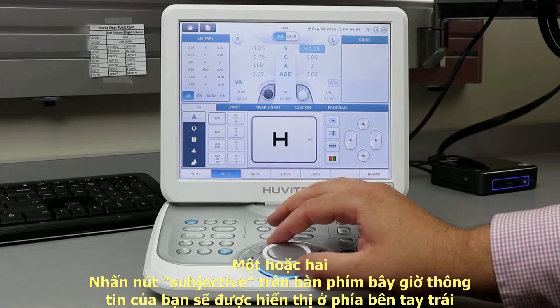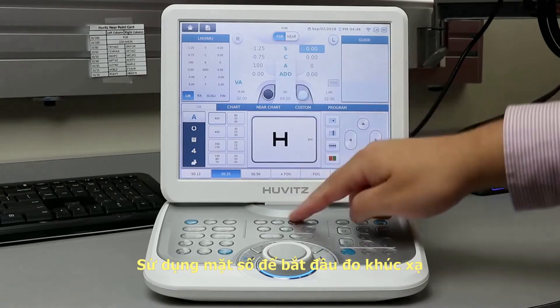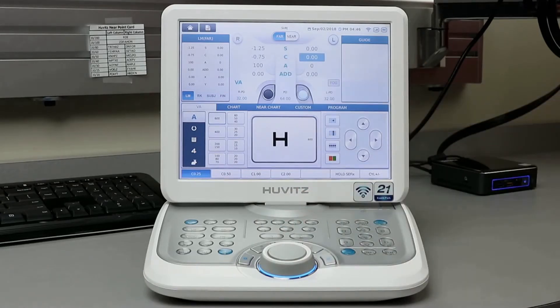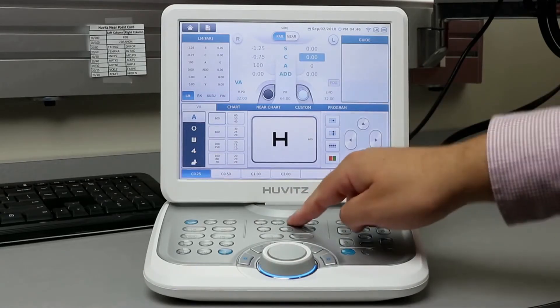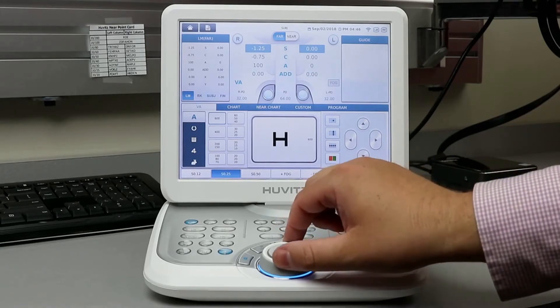You can change between sphere, cylinder, axis, and add using the corresponding letters on the keypad, or utilize the touchscreen feature and touch the letter on the screen. Use the dial to change the value of each option as you see fit.